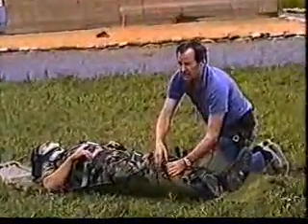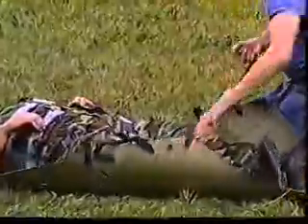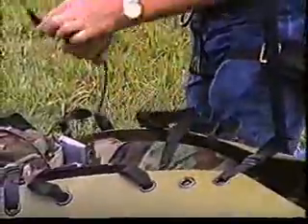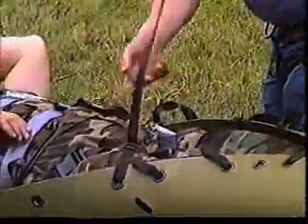Okay, this is what I was talking about in a situation if you're in a place where you don't have time to thread those buckles. That's what the plastic buckle is for. I've got one at the top end. I'll show you in a second. Are you okay?